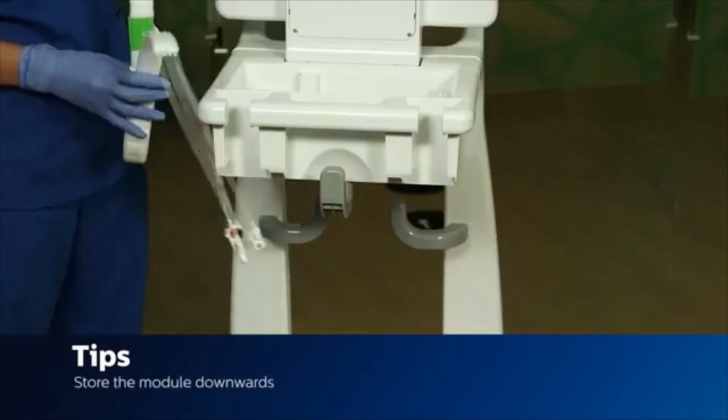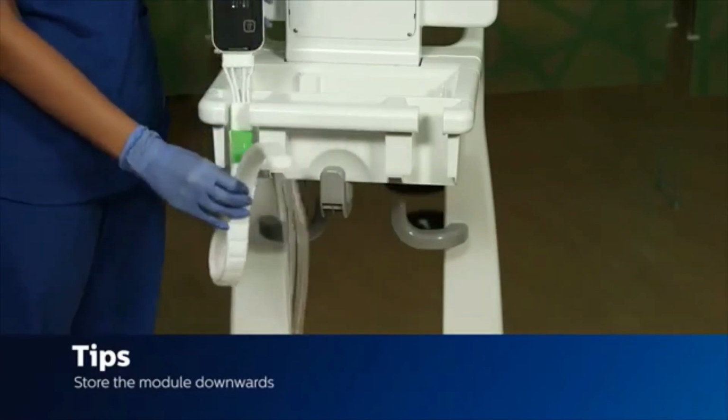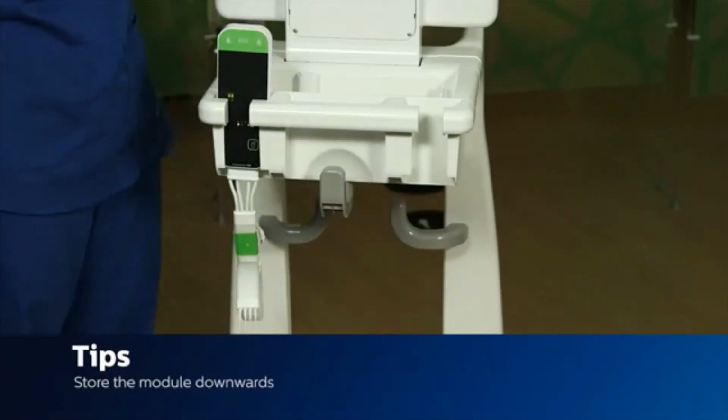When storing the module after the case, make sure to store it downwards where the leads are hanging. Storing it upwards will stress the cable and eventually break them.